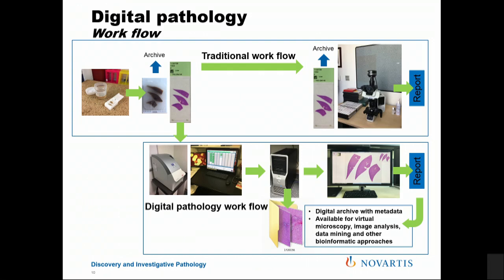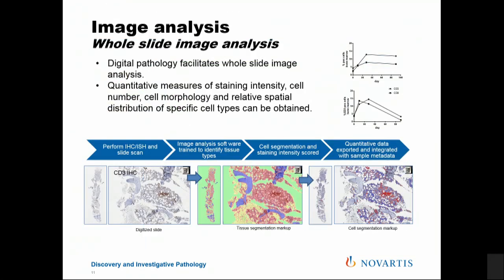So the pathologist can look for a particular morphologic diagnosis, recall all of the slides that had this diagnosis, and look for associations with patient metadata. The real advance will occur as we apply deep learning to these slides to generate novel patterns that can then be associated with diseases.